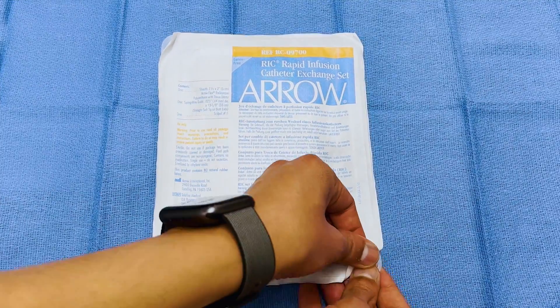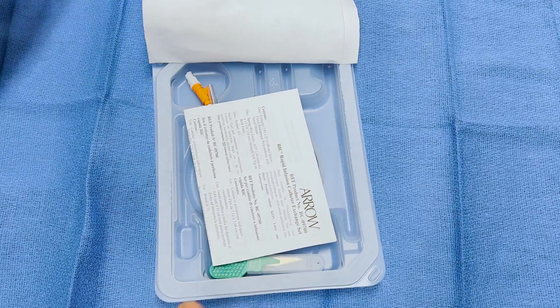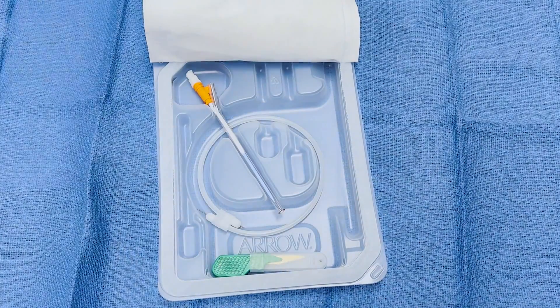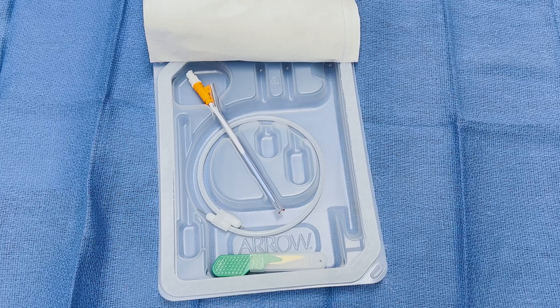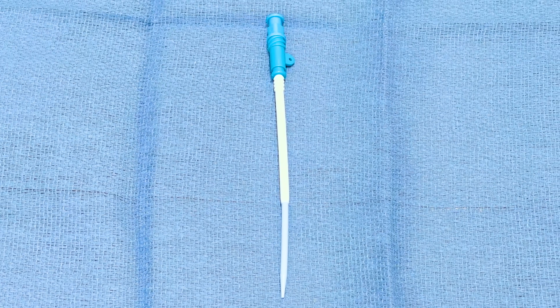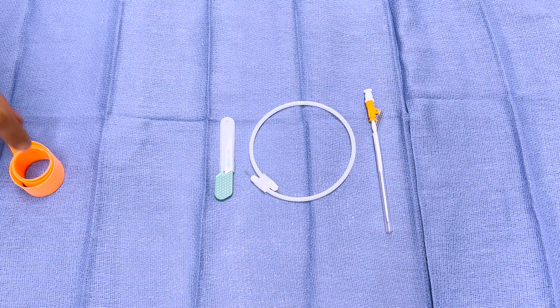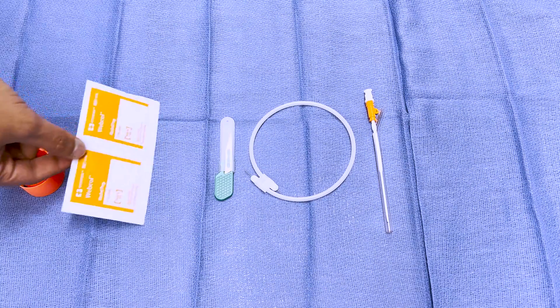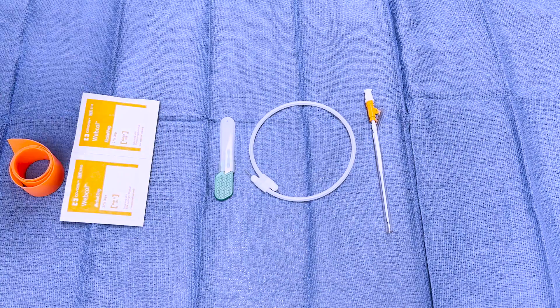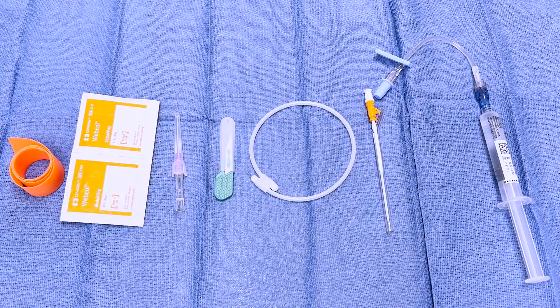Opening the package for this 7 French RIC kit, we see it contains three items: a RIC line with integrated dilator, a guide wire in plastic sheath, and a small scalpel. The 8.5 French RIC kit contains the same items except the hub of the 8.5 French catheter is blue in color. In addition to the items in the RIC kit, you will need a tourniquet, skin antiseptic, a 20-gauge IV catheter, and IV infusion tubing.